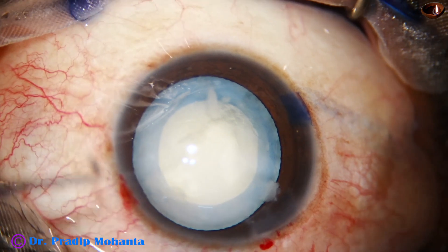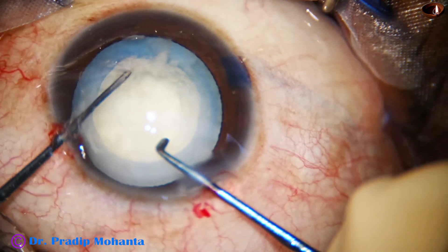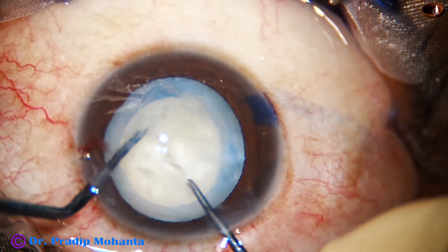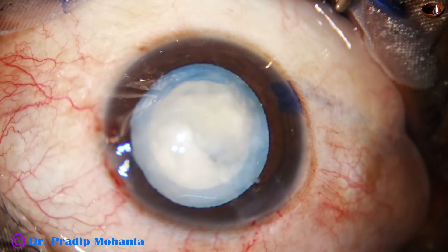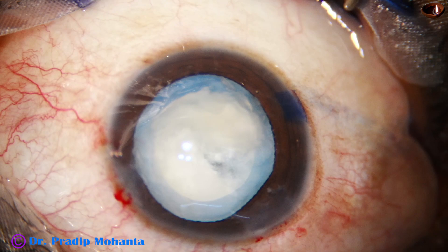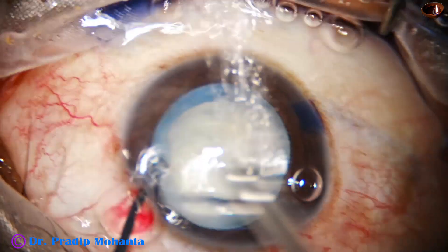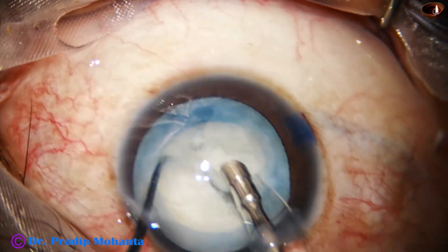If I try to catch this nucleus I may end up catching the posterior capsule, so I do a pre-chop. The pre-chopper goes only up to 1.8 millimeters and will not touch the posterior capsule. Moreover, the projected end is blunt and will not cause any piercing, tear, or cut of the posterior capsule even if touched. Now I go into the anterior chamber with the phaco needle.